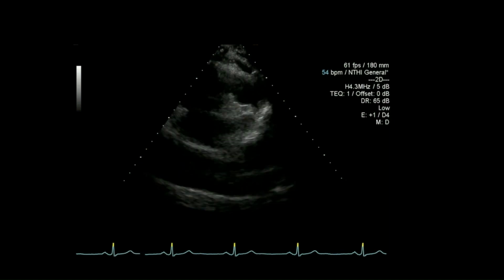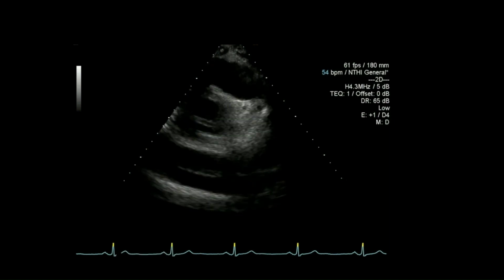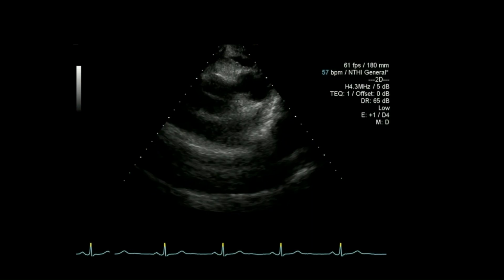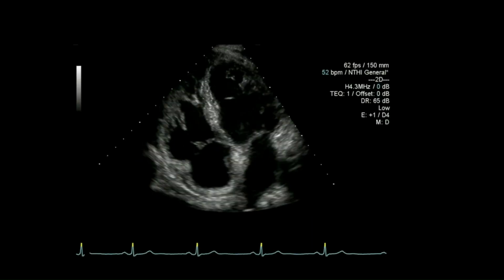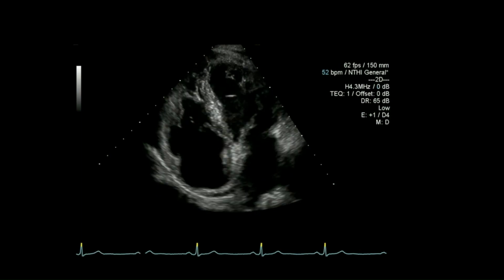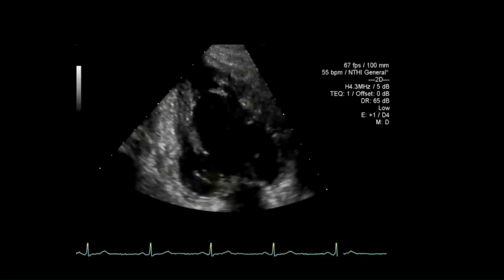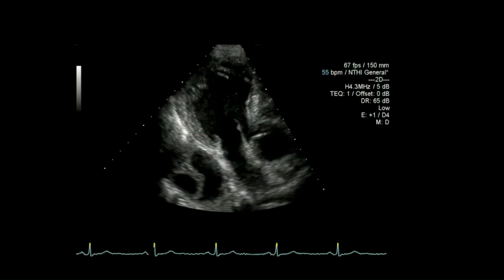And so when I look in the long axis at the descending aorta in the short axis view, you can actually see this flap extending along the length of the vessel. Coming down to the 4-chamber view, as I said before, normal ventricular function, as can be seen from the 4-chamber and the 2-chamber, and the long axis view.